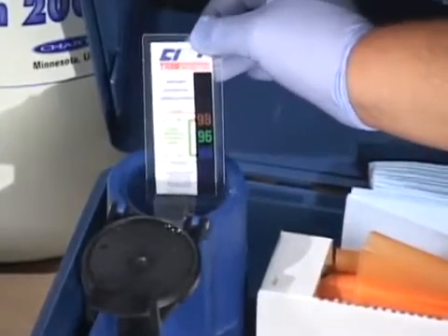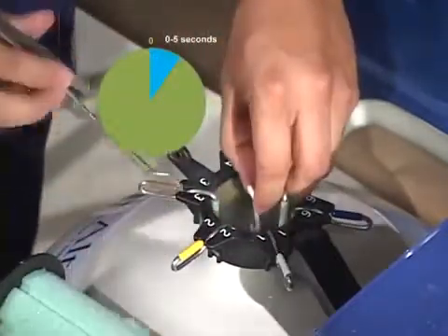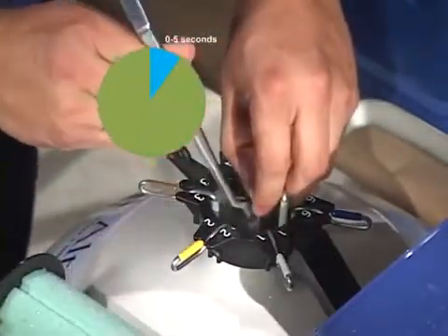With the tweezers, remove the straw from the storage tank and place it immediately — taking no more than five seconds — in the thaw bath for at least 30 to 40 seconds.